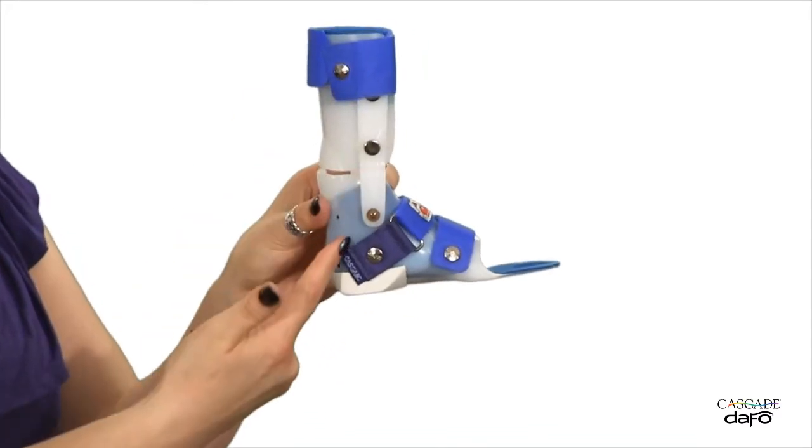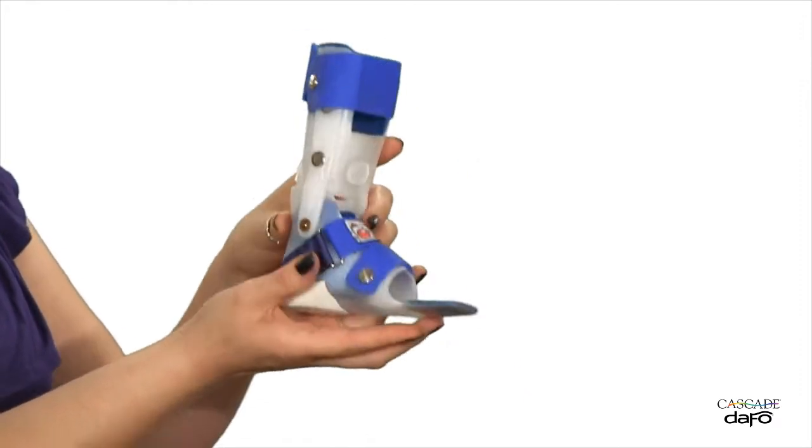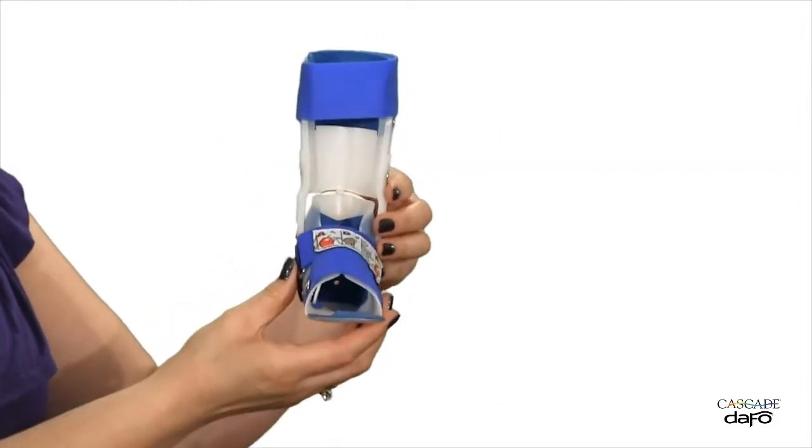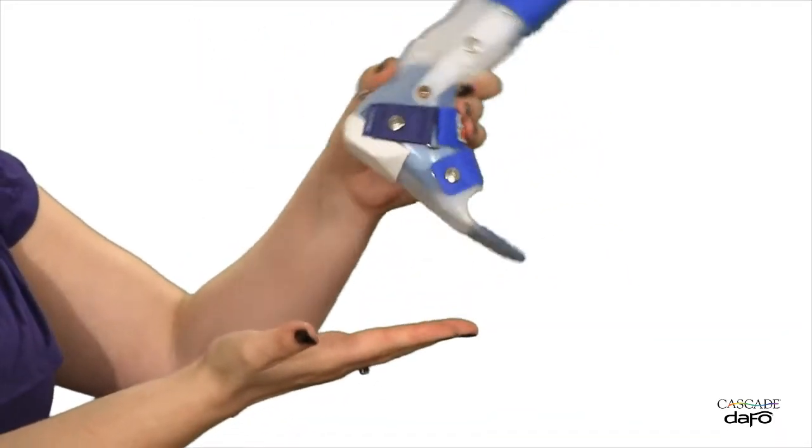The hinge proximal upright is designed to block ankle plantar flexion, allow free dorsal flexion, and provide additional medial lateral stability. The toe shelf is very flexible, allowing for easy toe-off.